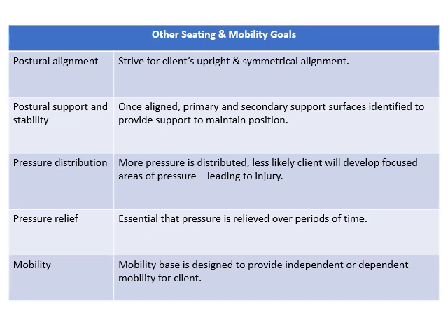Pressure distribution is of utmost importance because the more pressure is distributed, the less likely the client is to develop any areas of pressure that could lead to a pressure ulcer or to an injury. Pressure relief is essential, and so there are mechanisms that could be built into the seating system to allow for pressure relief. It's essential that pressure is relieved over longer periods of time.